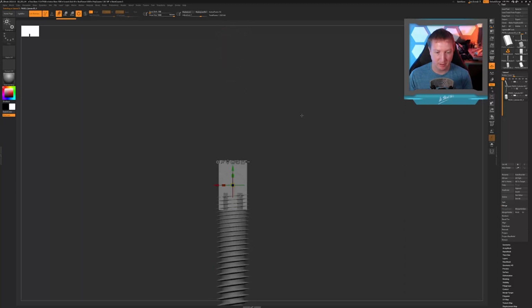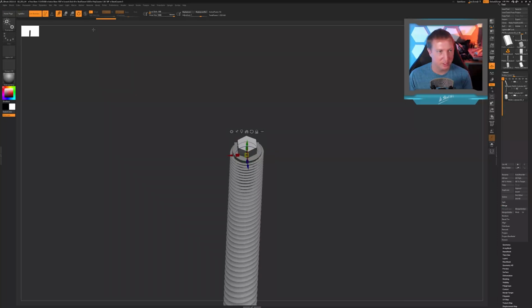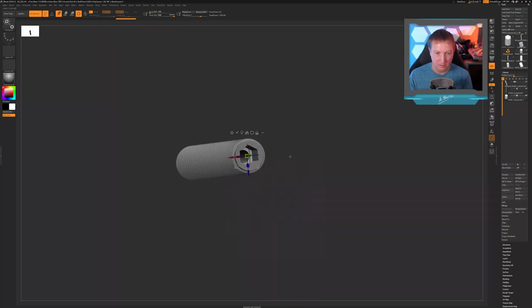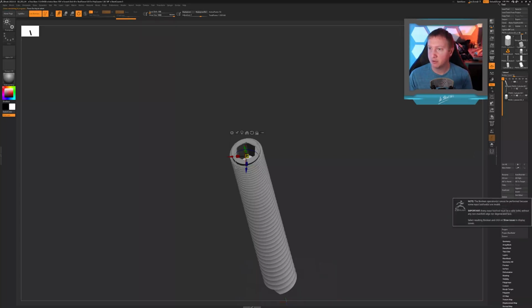Oops, I flipped over my model, and we need to make it a bit smaller. And we need to subtract that from our front geometry again, and then let's just figure out how deep in this thing we want this to go. About there, looks pretty good. All right, so now we've got both those subtracted, so let's come down here to our Boolean menu, and we will say make Boolean mesh 3D.